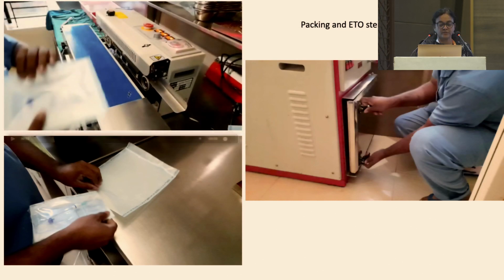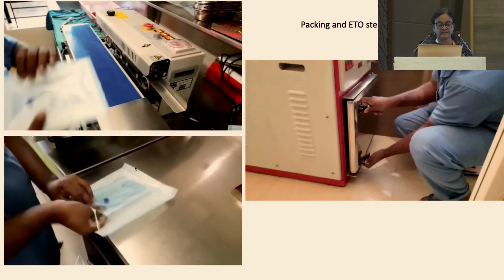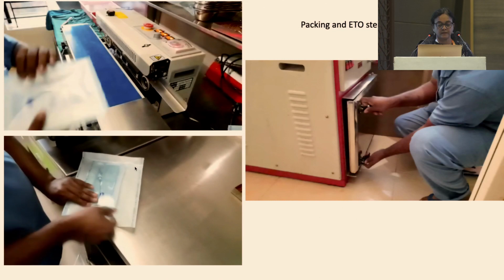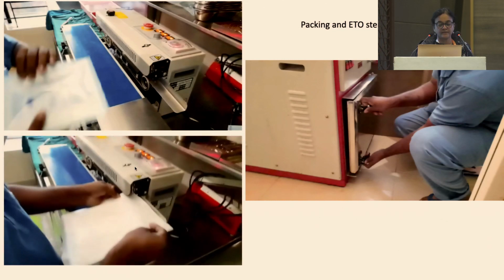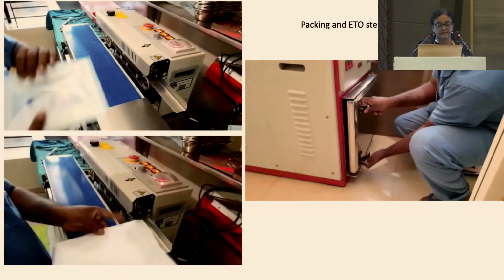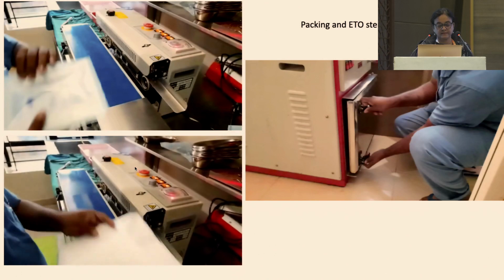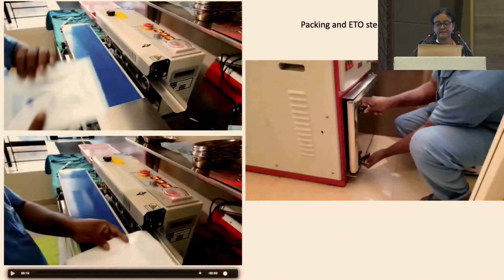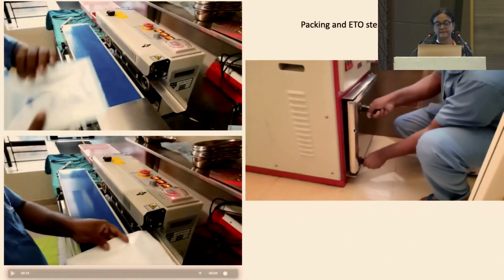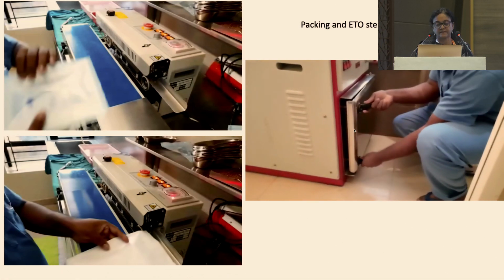And this pouch goes into a second larger pouch, and watertight foolproof sealing is done again, so that the sterilization is adequately done. This is then placed in the ETO chamber for the sterilization to occur.